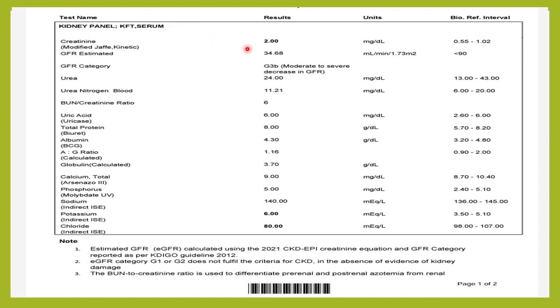So what all things do we have? We have the creatinine and we have the GFR also sometimes in the report. Sometimes you get the kidney function test report as extended, basic panel etc. in the laboratory. Sometimes when there is an extended panel, they include GFR also in this. GFR is nothing but glomerular filtration rate.